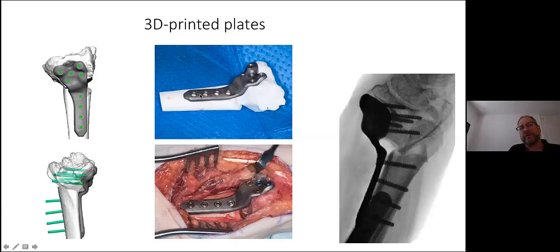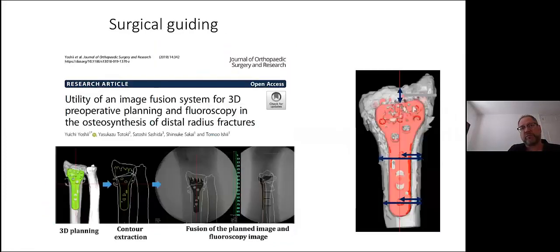So they 3D printed a titanium plate, and we used it during surgery, and it looks a little bit strange here. We did him 6 months ago, and he's better than I thought, actually. So I think there will be more of this, but this is of course complicated. I'm not sure we will do that in-house for a long time. Maybe the instrument companies will continue to do that.